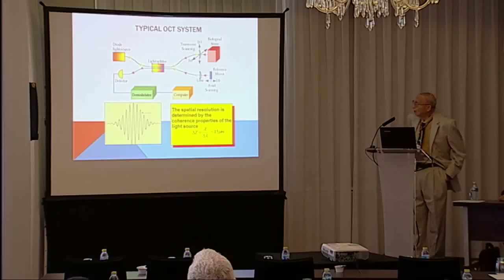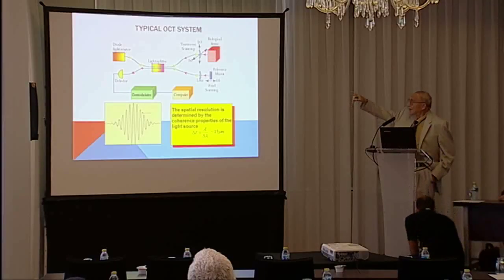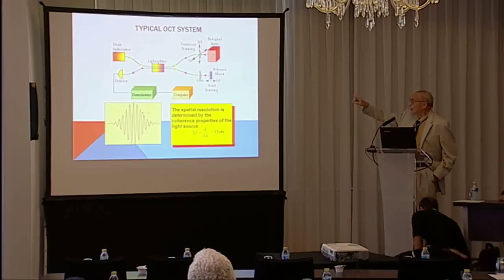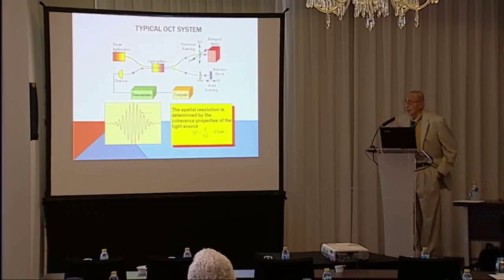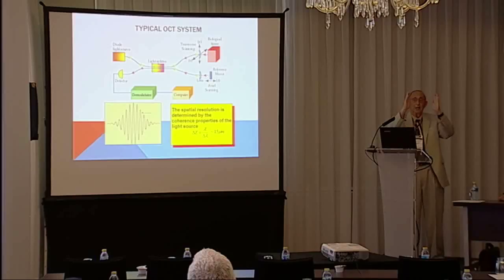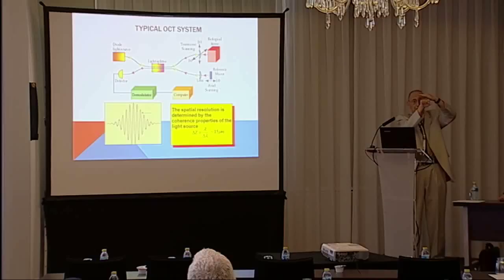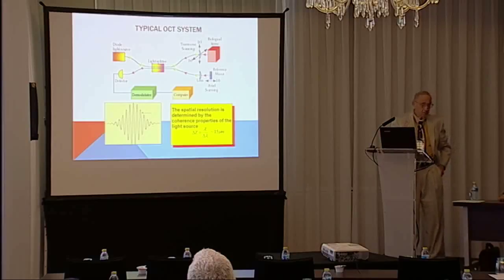This is a typical OCT system. You have your computer, your demodulator, your detector, your diode source, light splitter, your lens, and your tissue scanning. And what we want to do is miniature laser mirrors on each side and on the top. The tooth would go in the middle on here. And this is what the problem is, trying to miniaturize this so that it can be effective.